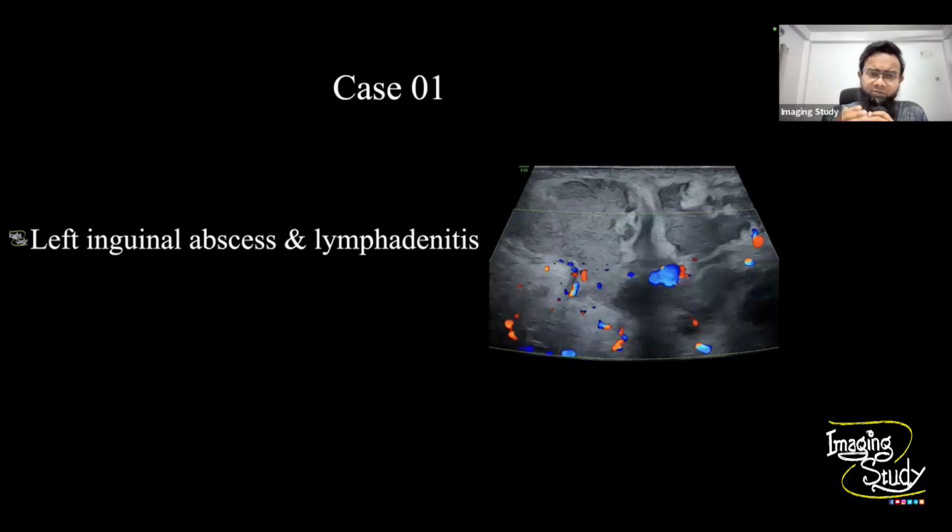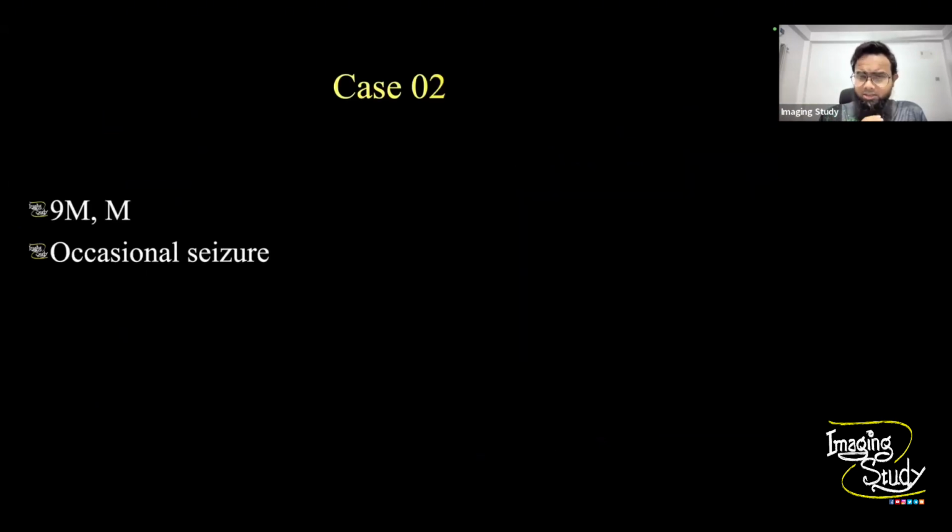So this was a case of left inguinal abscess as well as the lymphadenitis, which was the cause of formation of this abscess. Okay. So anyway, fresh case. Let's jump into the case number 2.